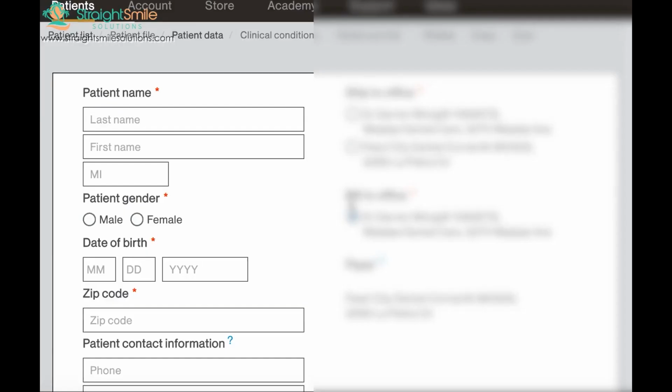Dr. Amanda with StraightSmile Solutions, and I'm going to do an updated video on this topic. It's always good to update it as time goes on. So we're going to talk about submitting an initial Invisalign case, what to do, what I recommend. This is something that I take my StraightSmile Solutions clients with. We do this one-on-one at our first visit if you are an Invisalign provider.